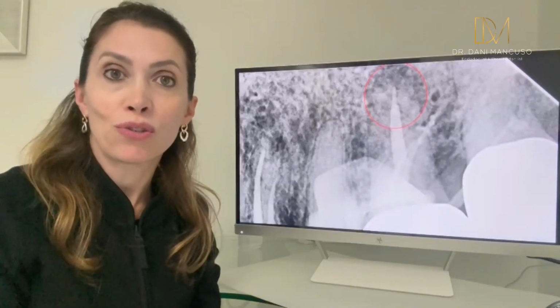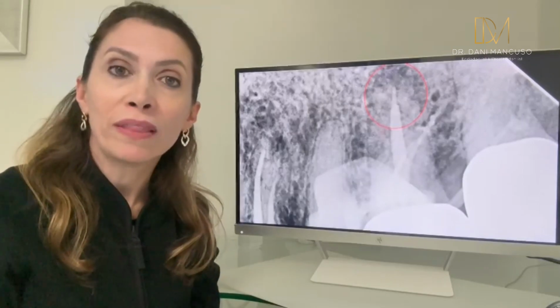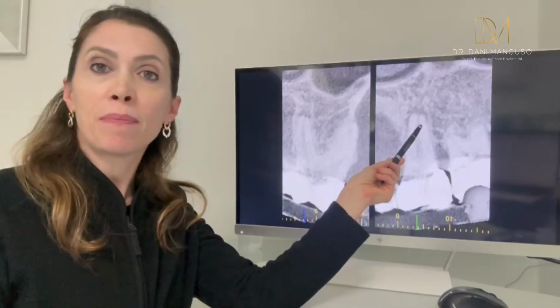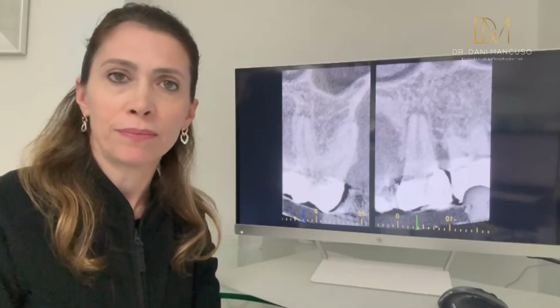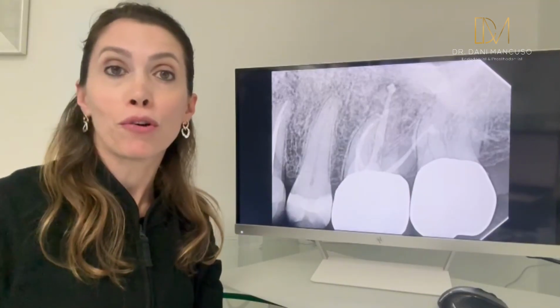Another thing we can do is take a CBCT beforehand, before the treatment, to see what the anatomy looks like. When you check the CBCT, you can see that the canal is quite large and the apex is large as well, almost opening in a small delta. If you finish with a GP that is too small, you are underfilling with your sealer, and that is when you can have problems of reinfection. The solution then is for you to gauge your GP before your obturation.